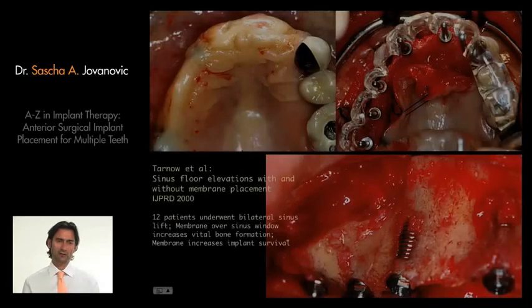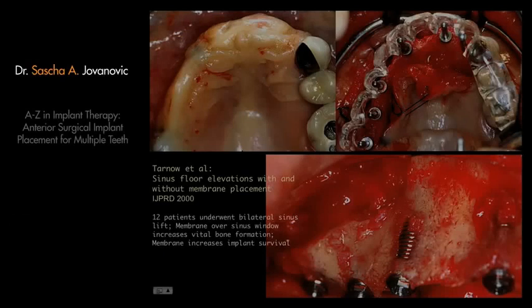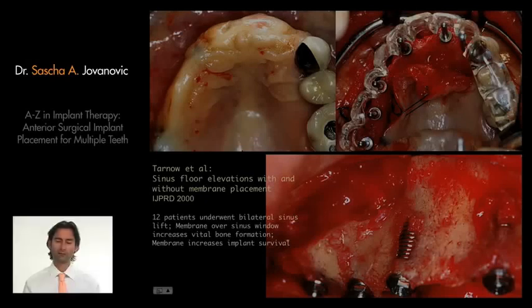Now I go to a more difficult area, and this will give you a combination of an aesthetic and a functional rehabilitation. This patient again was elderly. She was 60 plus, and she was wearing a removable partial denture, and she had 3 to 4 teeth remaining in her upper jaw. Through the advent and the evidence we have with implants, she came to the office asking, how can I have some fixed teeth?